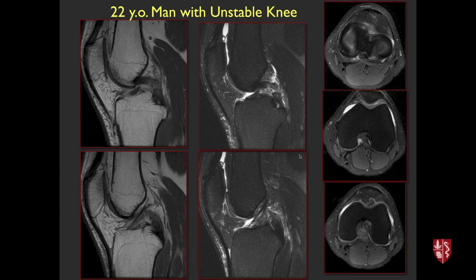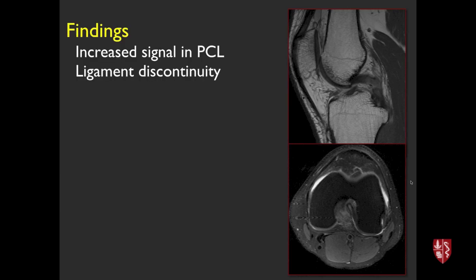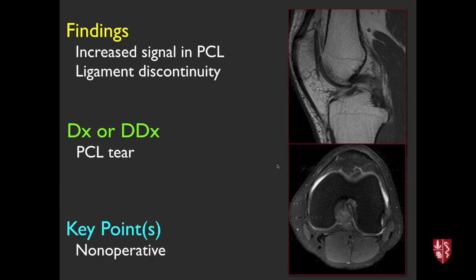22-year-old with unstable knee. MRI shows increased signal within the posterior cruciate ligament with discontinuity on axial images — a PCL tear. Fairly straightforward. PCL tears are usually treated non-operatively. If there's also an ACL tear, surgeons typically reconstruct the ACL but not necessarily the PCL.